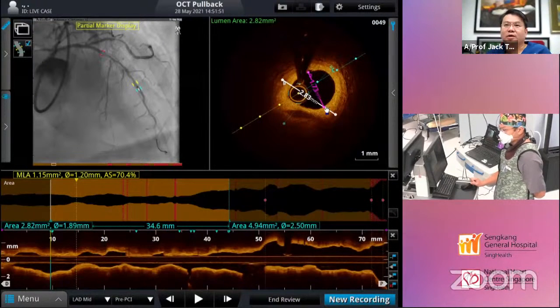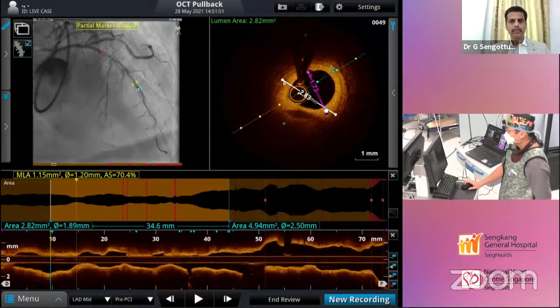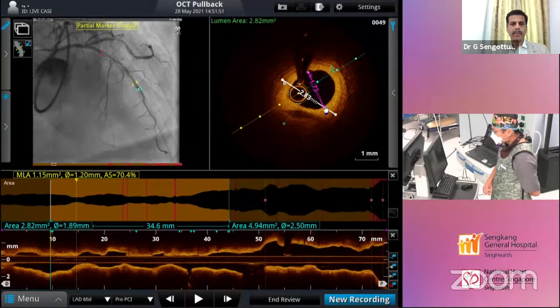Thanks, Anuruck. Sengkang? Yeah, sometimes in diffuse disease, the entire vessel is diseased. You will not be able to see the EEL at all, and then you have to go by the lumen diameter. Very often, as part of the Illumin 4 trial, we were always advised to check the EEL and downsize by quite a size. And if you're not able to see the EEL, then only you go to the lumen diameter, but then upsize it. Very often, if you downsize from the EEL or upsize from the lumen diameter, there is a match of the stent size in the majority of the cases.